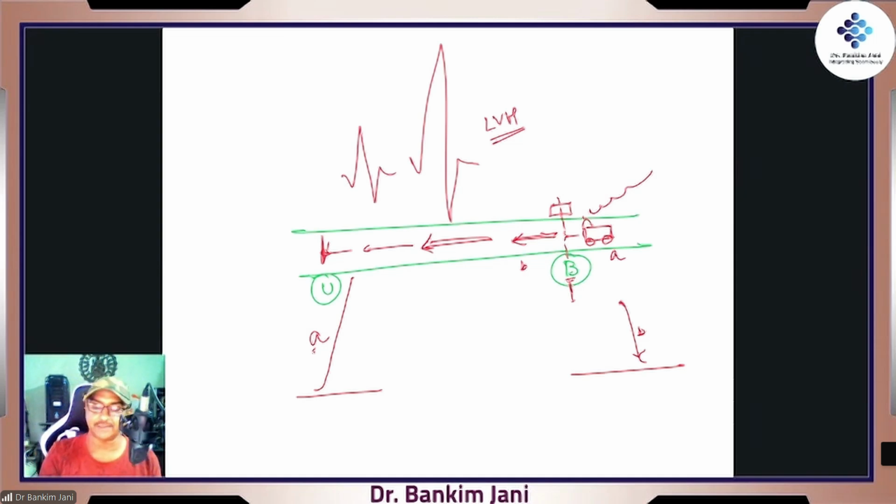So that's the reason we'll be able to understand cardiomegaly, whether there is an increase or decrease in the heart size, the rotation, whether there is some area where there is improper conduction, whether that conduction is related to atria or ventricles, all the things, more than 50 diagnoses. Yes, it will change the diagnosis, absolutely, fully.